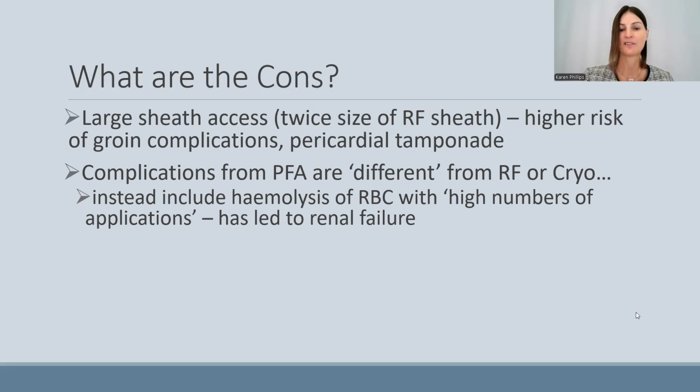And I'll come back to safety because the complications from pulse field ablation are different from the thermal radiofrequency or cryo. So I don't like people saying this ablation is safer because basically there are certain aspects where you can see increased risk of problems. And obviously the pros with this tissue selectivity where there's reduced chance of collateral tissue injury. So complications from pulse field ablation are different. And we didn't see this with RF or cryo, but you can actually see significant hemolysis of red blood cells with high numbers of applications. So basically the electric field, that 3D basket, is nicely zapping the cardiac tissue, but some red blood cells get caught up in the electric field and lead to hemolysis.